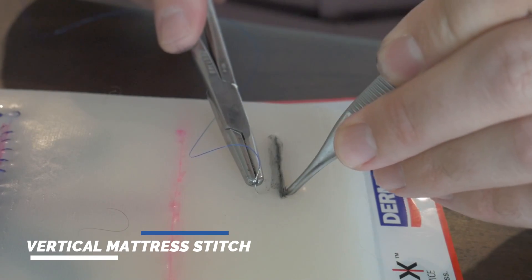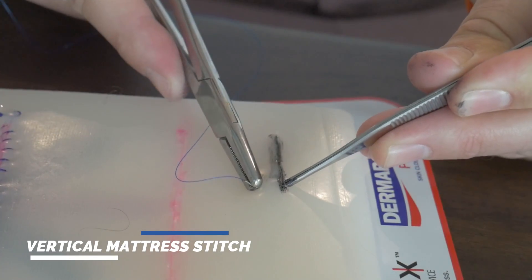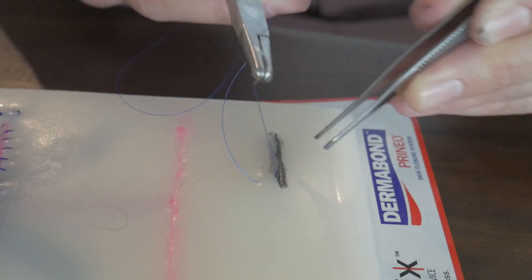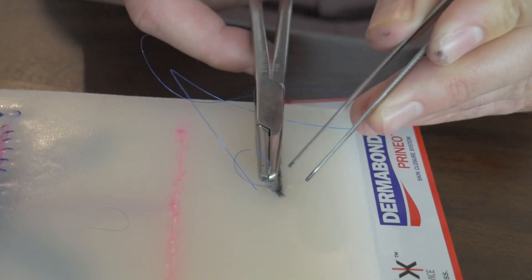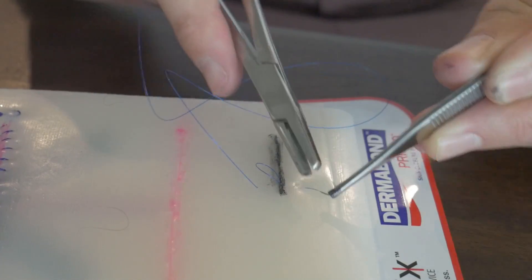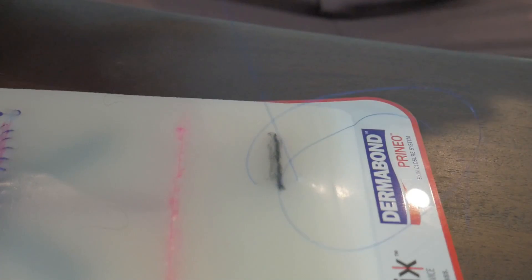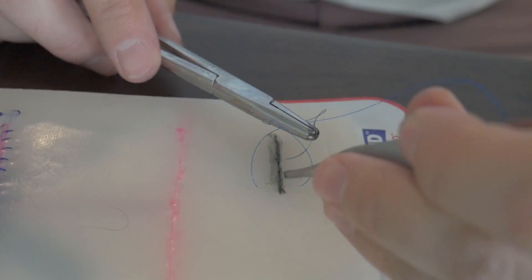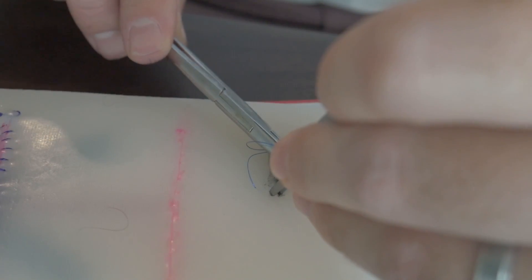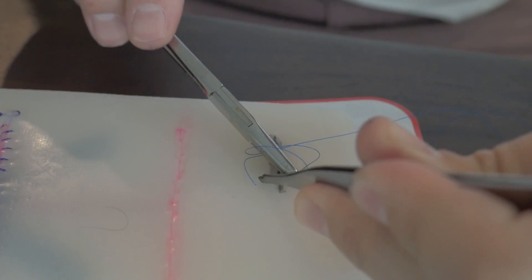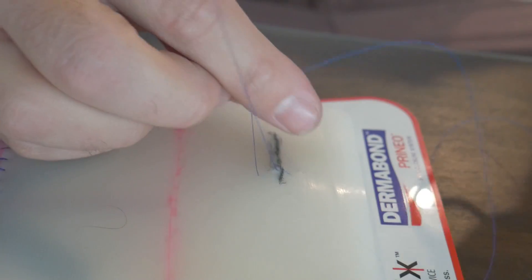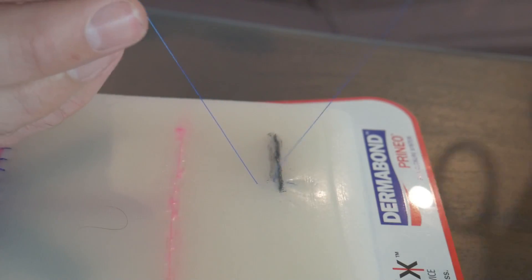Next stitch is going to be a vertical mattress stitch. This vertical mattress stitch I see used all the time on open wound cases. If you have infected wounds that have come back, if you've debrided them, you partially close them. Maybe some of the wound has been healed by secondary intention, but you still need to approximate the skin a little bit. You can approximate it with something like this, which is a vertical mattress stitch. Now, as you saw before I had the needle, you go far to far and you get one big bite. You try and get as much tissue as you can. And then you go near, near, close to the incision sites. And then you tie both ends on one side of the incision.